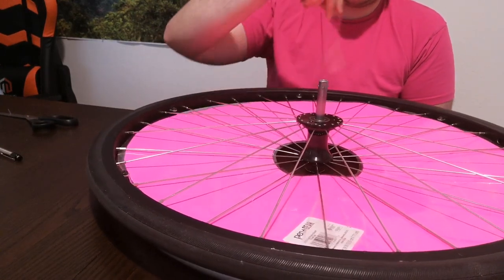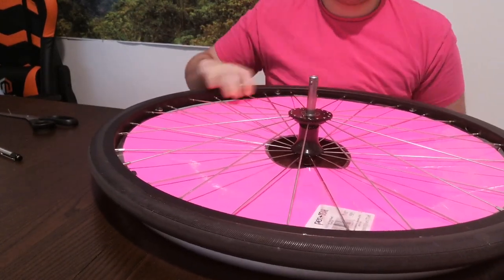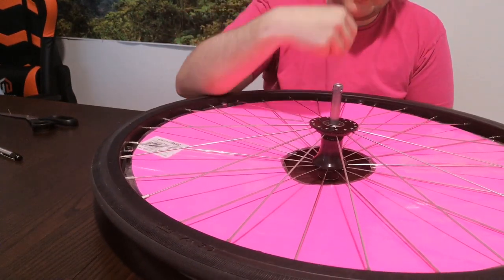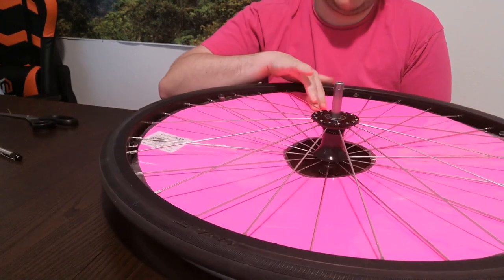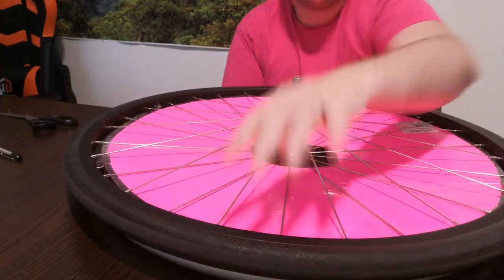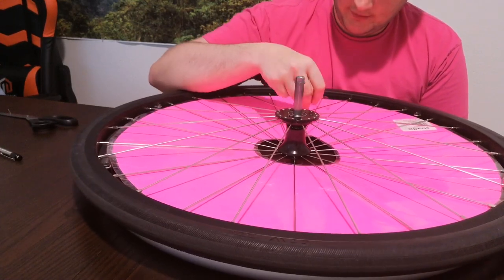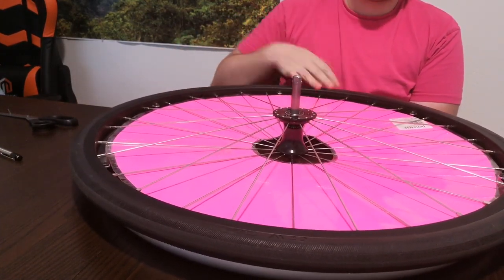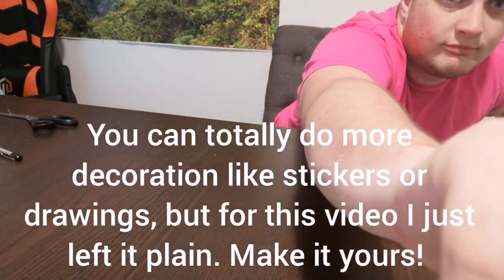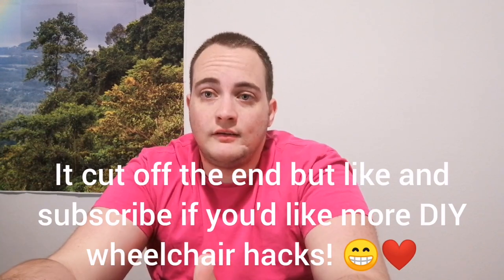Make sure it's pretty much flat. And with that, you are now the proud owner of a spoke guard for less than a dollar. Enjoy! Hope you enjoyed that video. Let me know down in the comments if there's anything else DIY you'd like to see with the wheelchair.